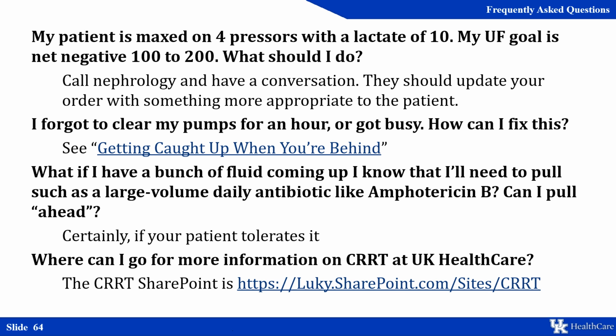Next question. What if I have a bunch of fluid that I know that my patient is about to get, such as amphotericin B? Can I go ahead and start pulling now, knowing that I'll get it, let's say, at noon? The answer is of course. If your patient tolerates it, you can start pre-pulling so that you won't be as far behind when you hang that.